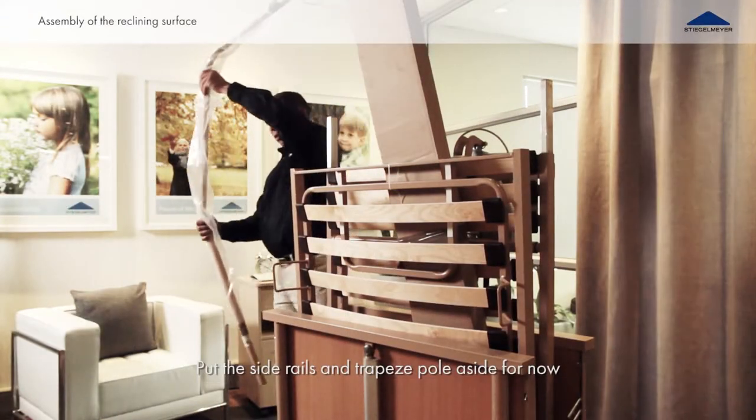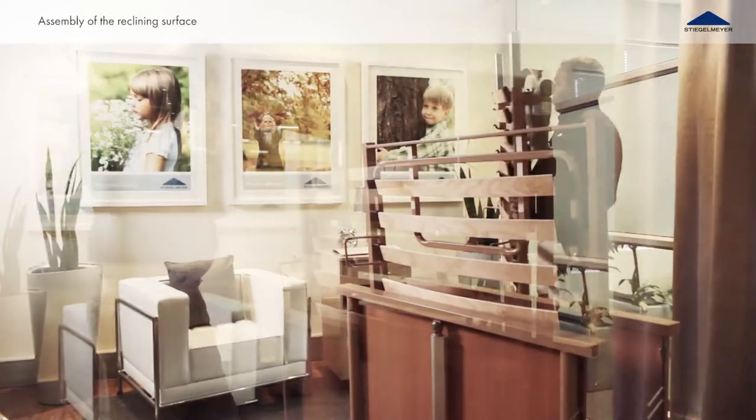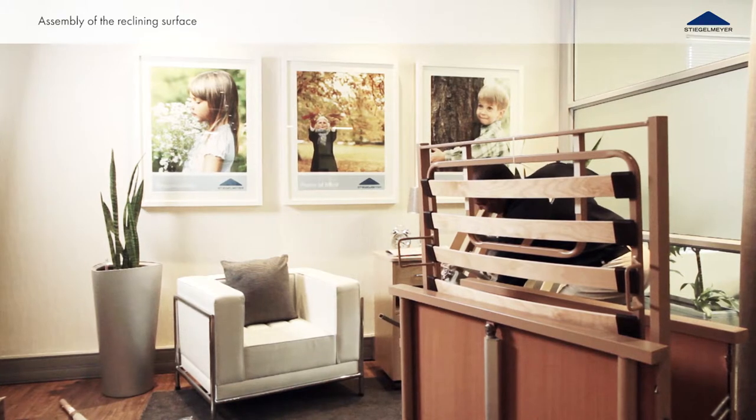Remove the side rails and trapeze pole from the storage aid. Remove the two halves of the reclining surface.